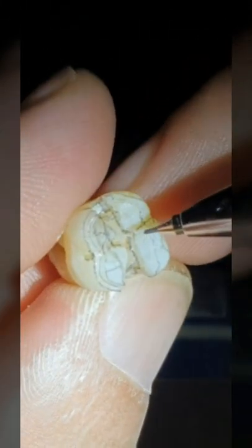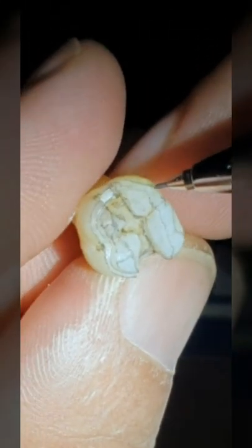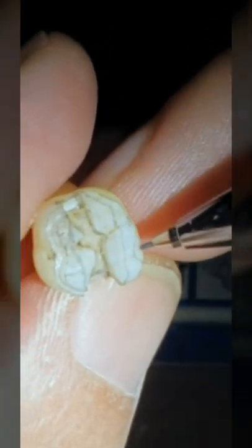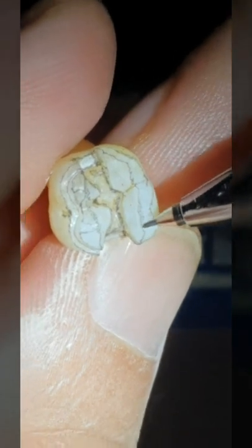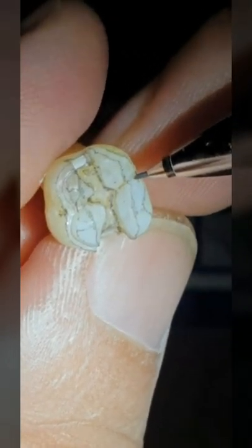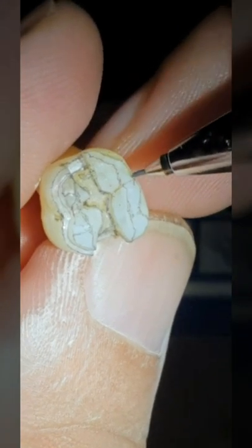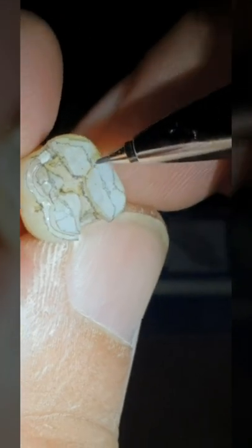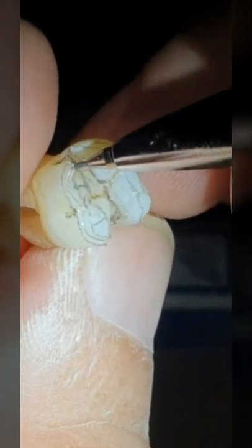Okay, so here we are looking at a couple of preps. The one on the lingual has a very sharp angle, and that would suffice when it comes to a metal crown like a gold or some other alloy, but it would not suffice if you're doing any porcelain work up on top or zirconia. For that you need a definite shoulder.